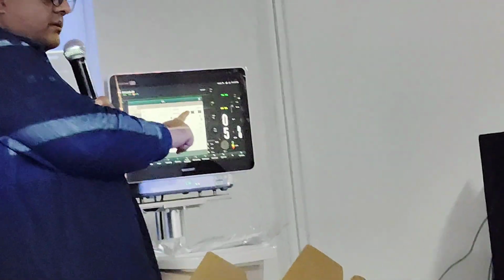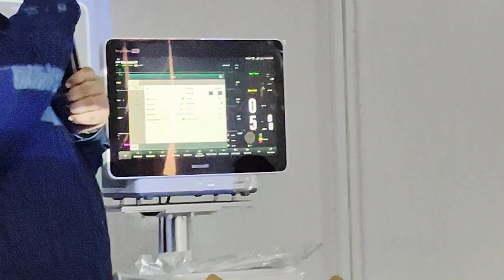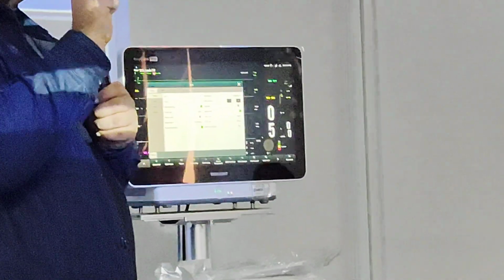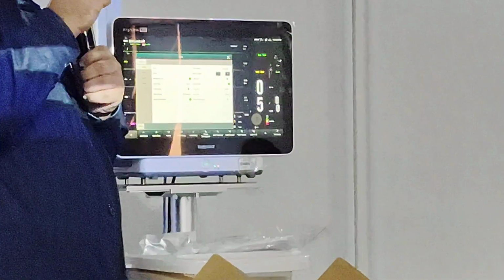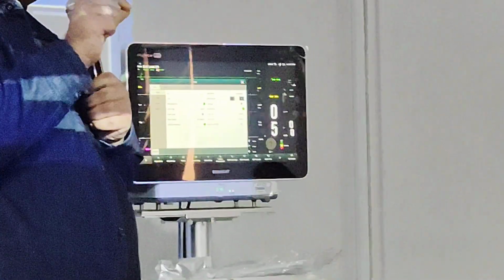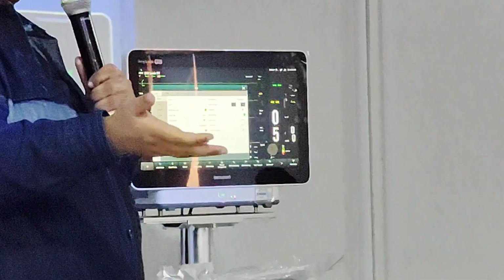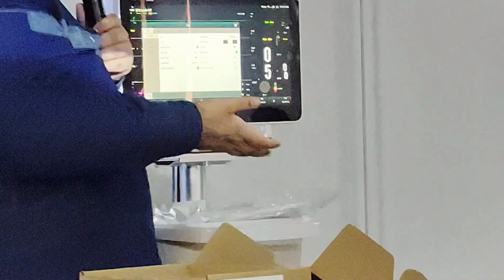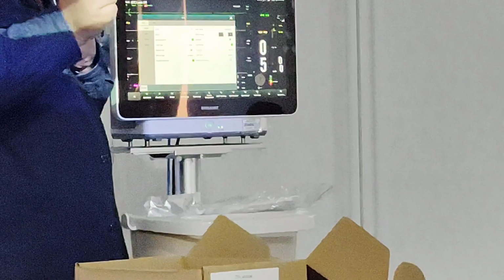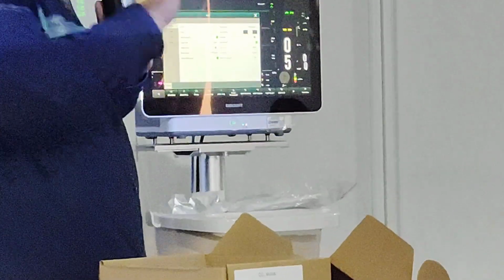Another thing is, you see the filter mode being used here? The filter mode here is diagnose. When you use diagnose filter mode, it's showing you every single detail in the ECG. It's okay to see every single detail, but when you're monitoring a patient, you don't want to see the noise. Do you like ECG noise? Nobody wants to see that. So why do you keep using diagnose? That wouldn't be right. So what you can do is go over here, there are 4 modes.